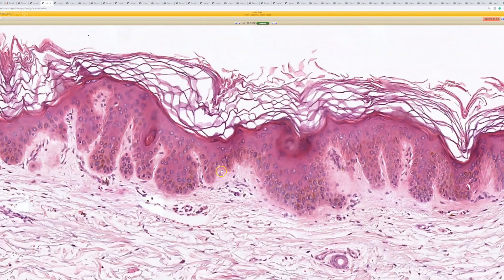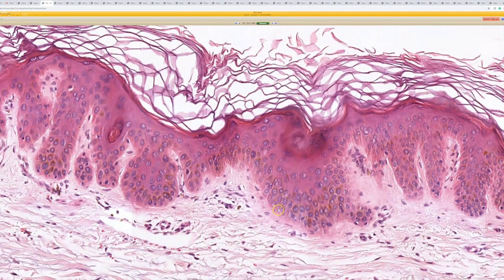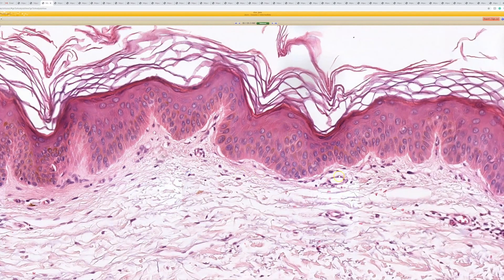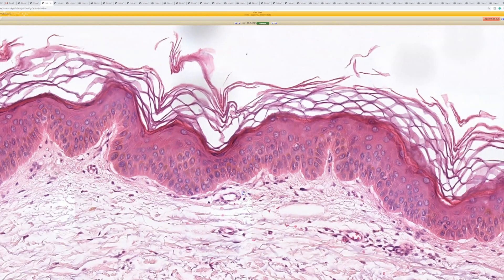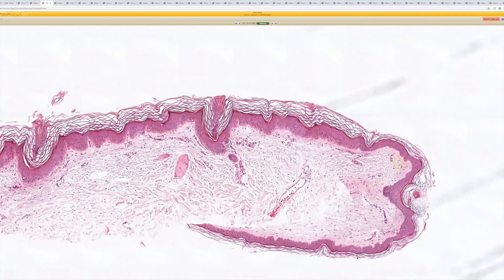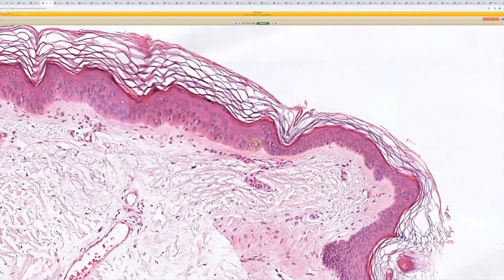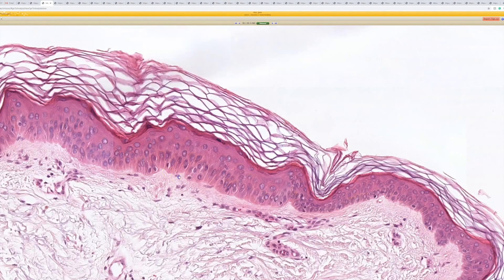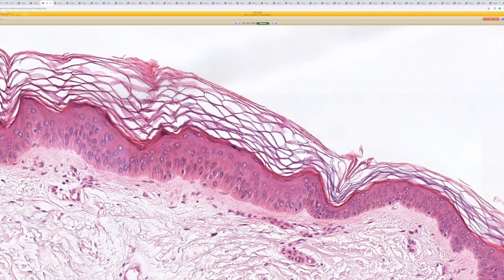Going closer, I think it's a large cell acanthoma. The cells are certainly large but they don't look atypical for an actinic keratosis. When we go over to the side you can see a more abrupt cutoff between the large cells and the smaller cells. The normal keratinocytes in the background are small, and all of a sudden they get really big — uniformly large — and there's usually orthokeratin rather than parakeratin on top.